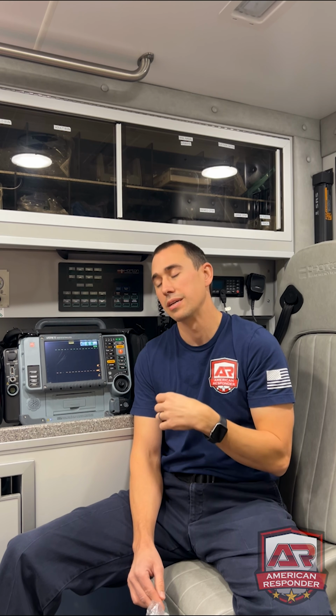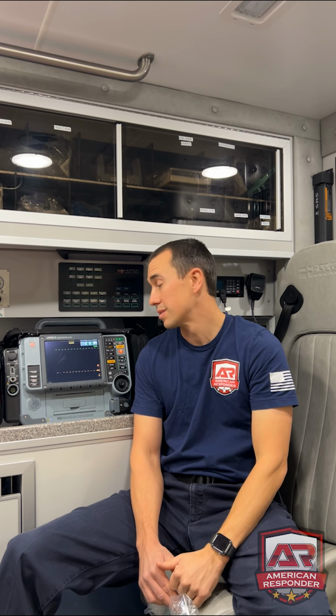High end tidals are from acidosis. That's people that aren't breathing that much, so they're retaining CO2. Your asthmatics can't get that CO2 out, and that's when you're going to have that high end tidal. Also, if they're not breathing enough. If you're breathing really slowly, like your overdose patients, they're going to have really slow respirations. That builds CO2 in their body, so they're not able to expel it. That's also a reason for high end tidal.